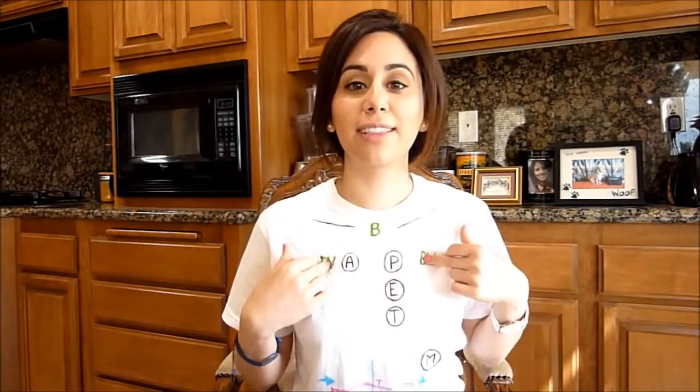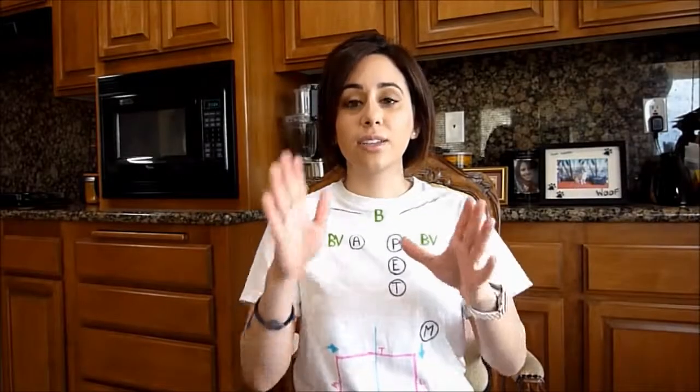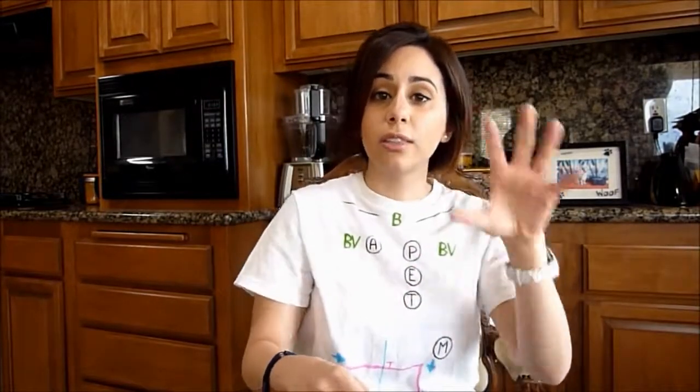So that is bronchial. And then we have bronchovesicular, which is right and left mid-clavicular line, second intercostal space, which I have right there. And then we have vesicular, which is over your entire surface area of your thoracic cavity. So it's anterior, posterior, and lateral. An easy way to find your vesicular sounds on the back is to find the scapulae. Go like this, and find the scapulae, and go right in between with the diaphragm of your stethoscope, like that, and go down. And don't take your stethoscope off the patient. Glide it on there so that it's easier to compare your left and right lungs.